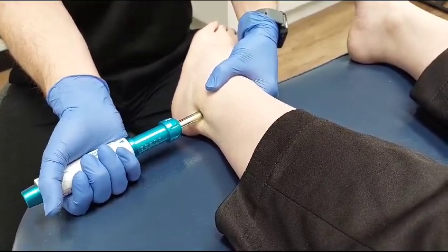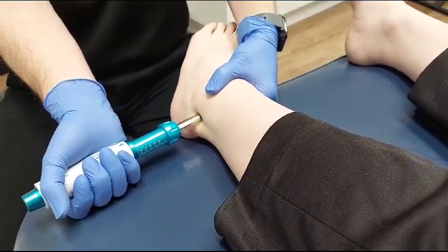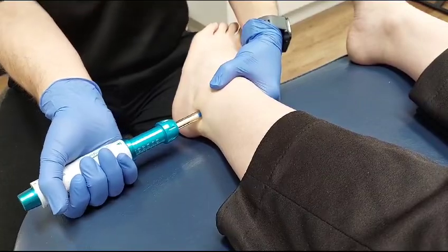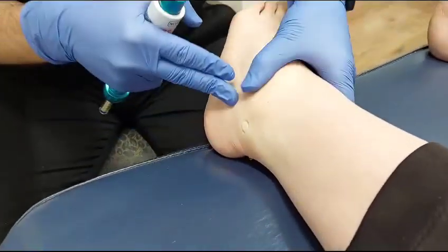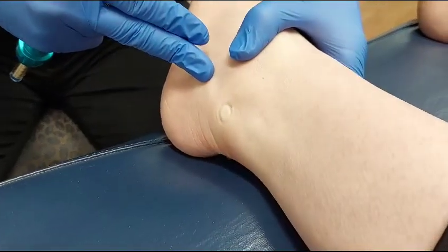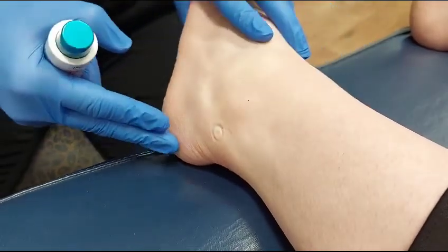Release the pressure slowly and give it a bit of a wriggle to help massage the fluid in. If you pull it straight off straight away, it does have a tendency to bleed a little. And we remove that — and you can barely see that anything's happened.